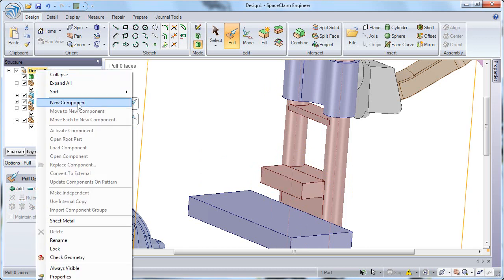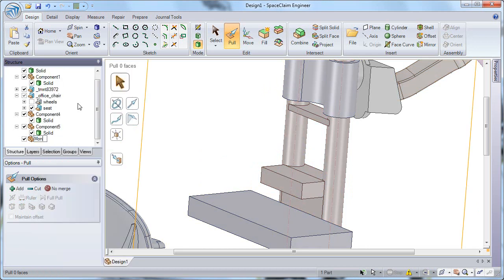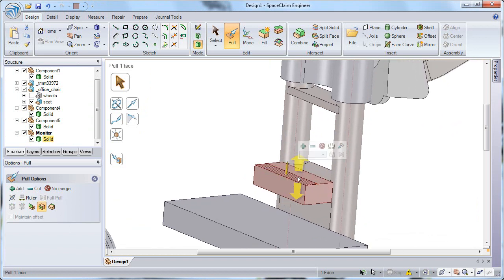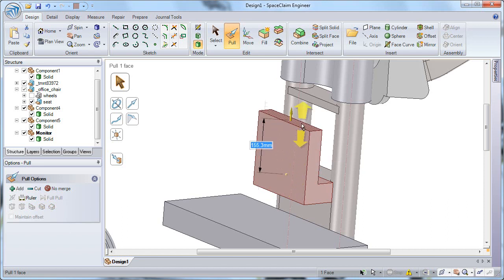I'll right-click on Design 1, choose New Component, and name that Monitor. And now I'll drag the solid that I created down into that component level, and so we have a new component to house that monitor. So I'd like to make a few more edits to the geometry. Again, clicking on the edge, choosing Copy Edge option, I'll copy that edge inward, creating a new face on the top of that solid, and then I'll pull up on that face to add geometry.